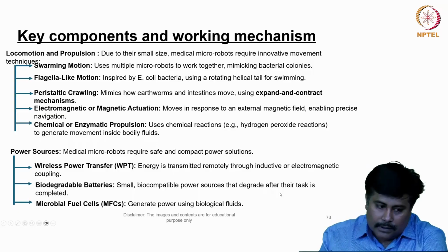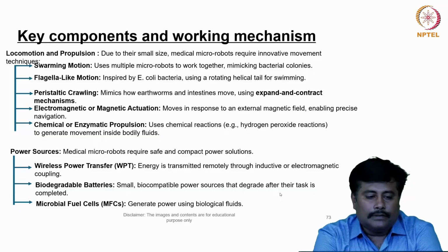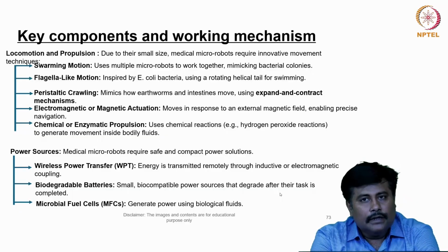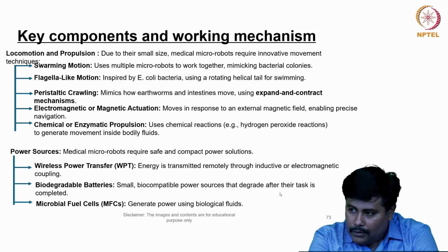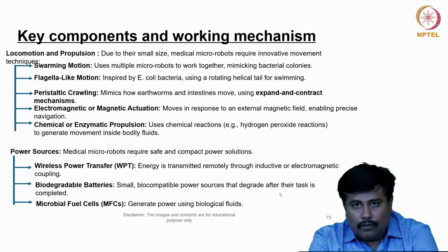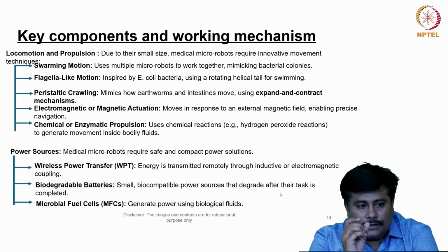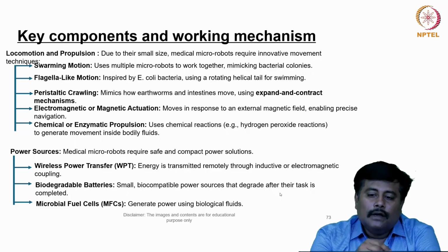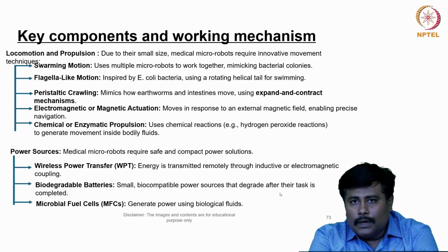Now let us discuss some of the key components and working mechanisms. In this particular case study, we are focusing more on lasers and micro robotic systems for endoscopic related applications. So in this concern, we will be discussing locomotion and propulsion. Due to their small size, medical micro robots require innovative movement techniques.